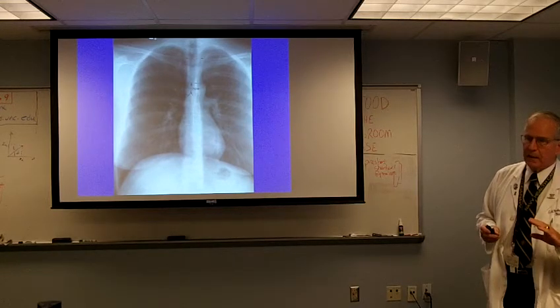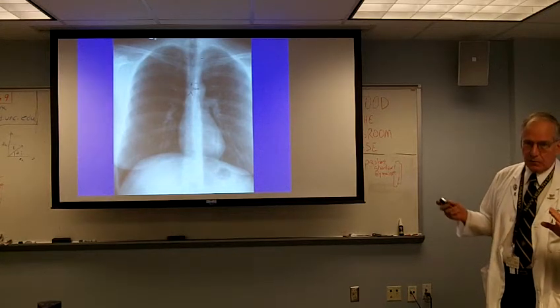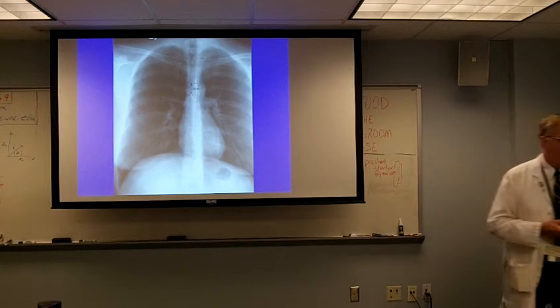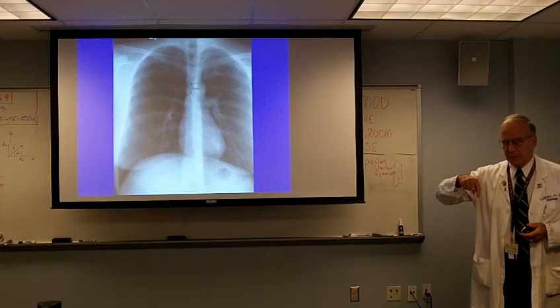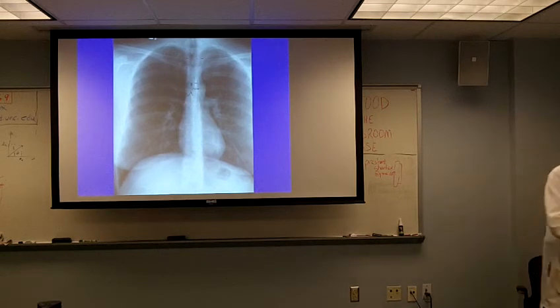And it's one of the things that is almost always overlooked by house staff and by some of my colleagues, is that they just don't focus on the fact that the balloon is overdistended, and you can easily overdistend these to greater caliber than the airway, because remember, the posterior portion of the trachea is membranous, and so you don't appreciate just how far that balloon has distended it posteriorly.